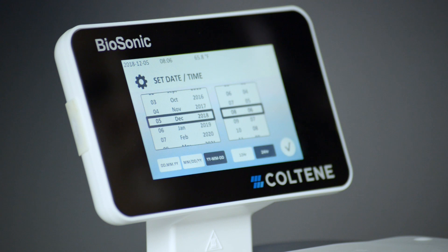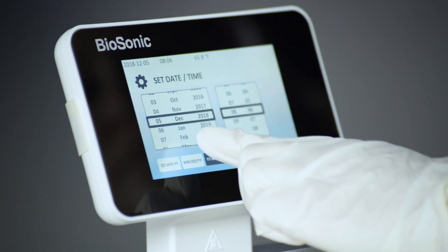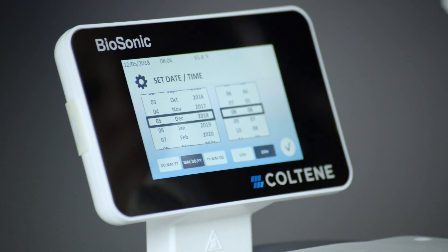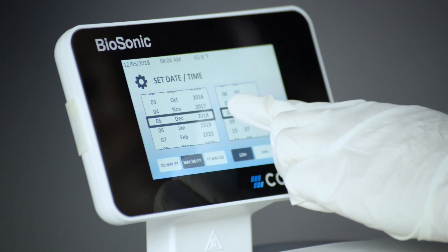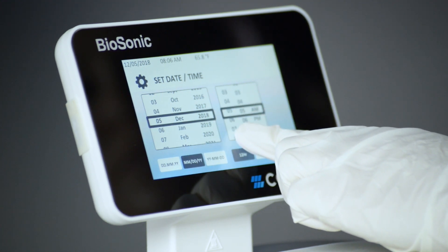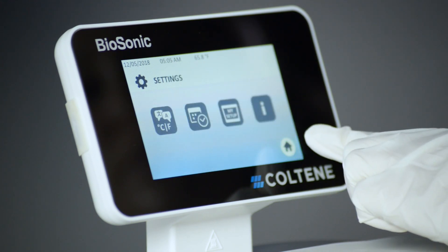On the second setup screen, set the date and time with your preferred format using the drop-down list and format buttons. You can choose one of three date formats. Press the checkmark button to accept.